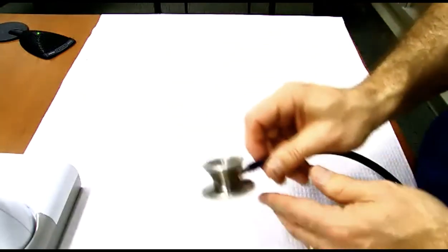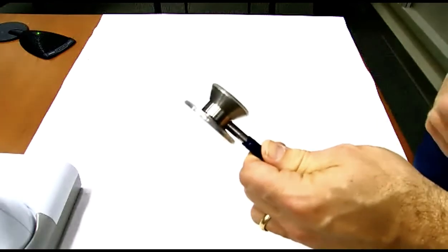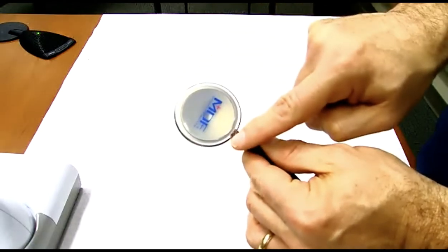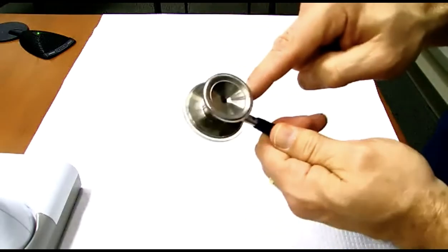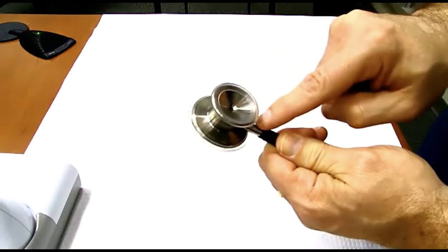Let's talk about the working end of the stethoscope. We've made you buy a pretty good stethoscope, meaning pretty good because it's got two different heads on the end of it. The wider one is the one that we call the diaphragm. And you should hopefully have a cool little KU monogram on here. One side is called the diaphragm. The other side that you can listen from is called the bell. The smaller side is called the bell.